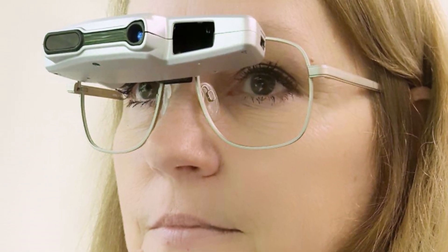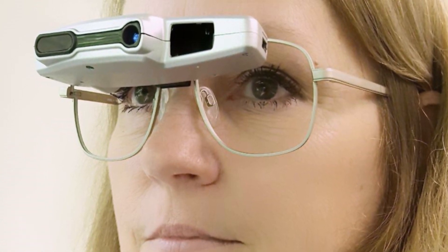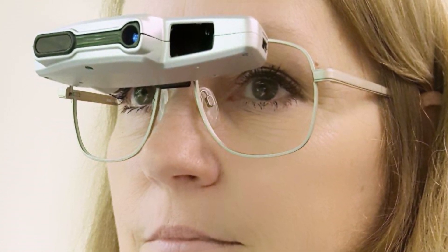That way it only takes a small drop of their chin and tilt forward for them to be looking directly on a line of sight through the middle of that telescope.